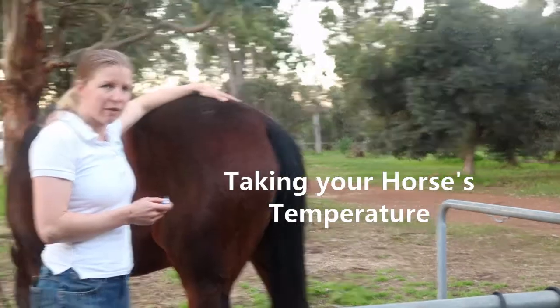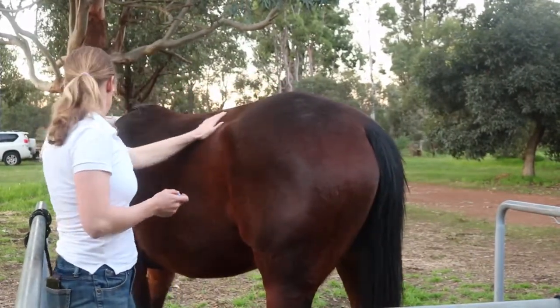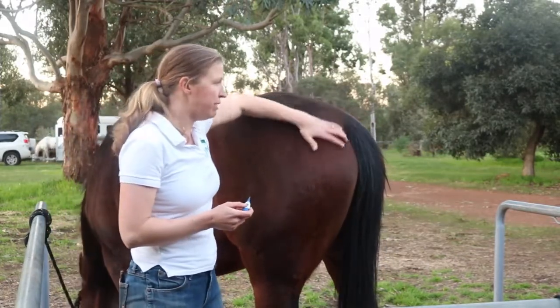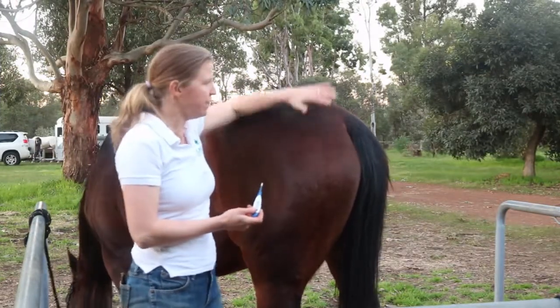What I'm going to do now is just check Maverick's temperature. You need to make sure it's a horse that's been well handled and they're okay with you being around the back end. If they're not, then you need to do some training before you can do this safely.